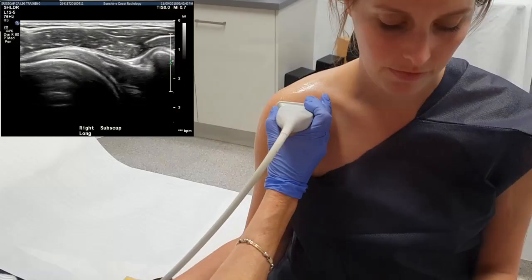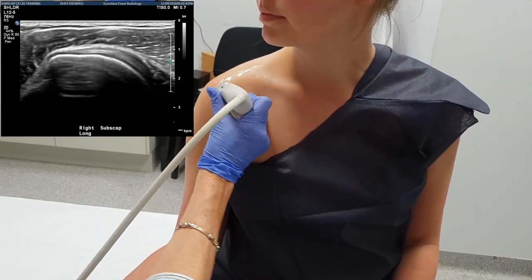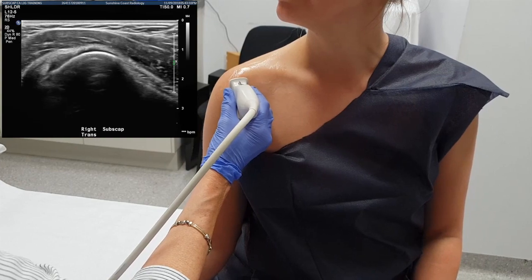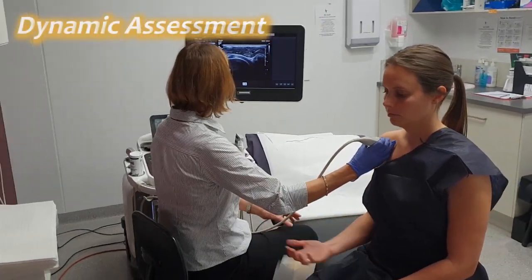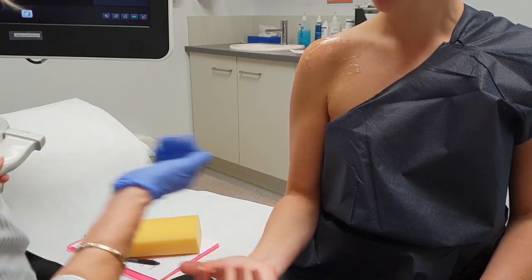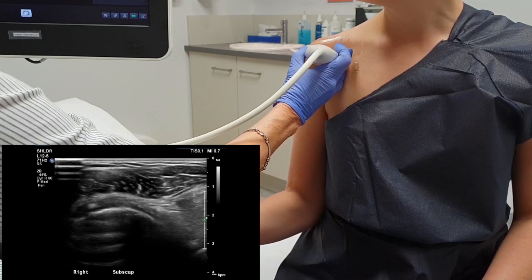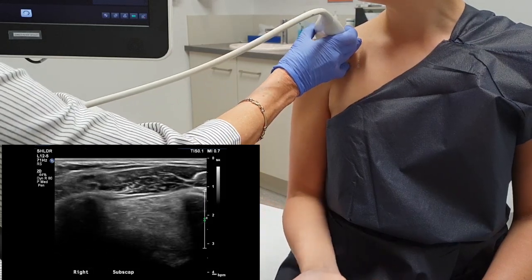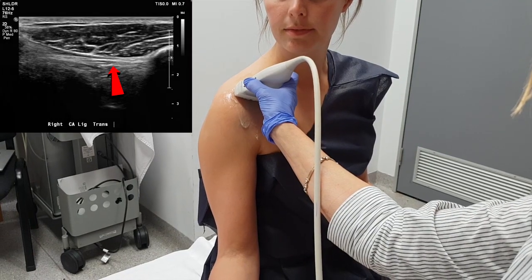Then you work your way out to the lateral part of the subscap. It's important to remember that you've got to examine the whole of the subscap. I look at the subscap in transverse, starting at the coracoid and working my way out laterally. Of course, if you've seen what you think is a tear, you get a different angle of it. You're going to have a look at the subscap moving — get the patient to keep their elbow where it is and take their arm in and out. This allows us to check that the biceps tendon stays in the bicipital groove and doesn't dislocate out of it, and also allows you to see if there's any bunching of the bursa under the CA ligament. Once the patient's in that position, you can easily swing around and get a nice CA ligament view.